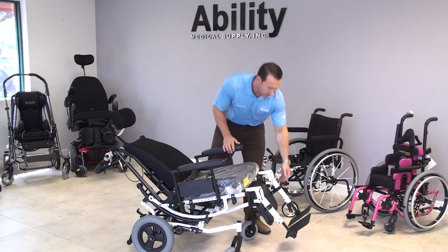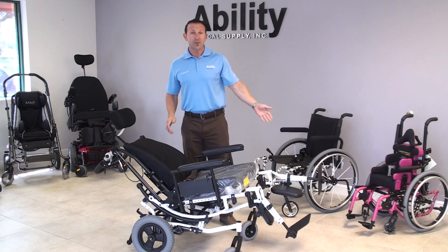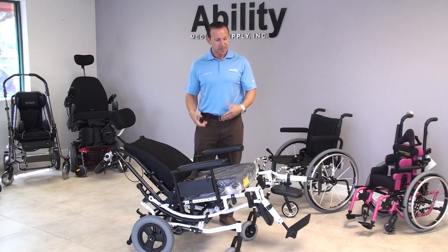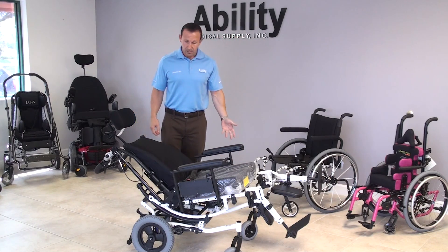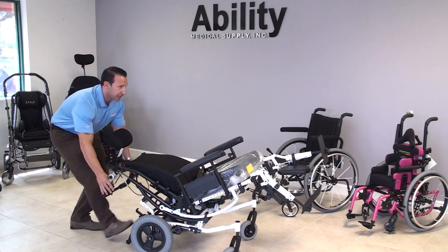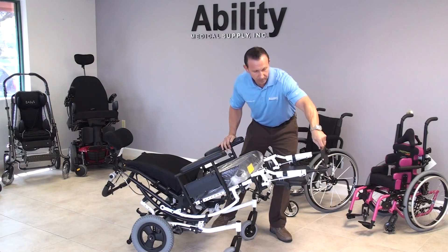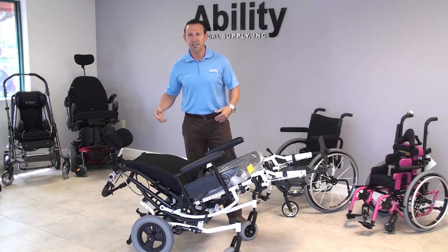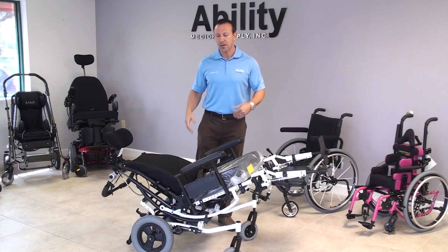Another great feature this chair has is what we call elevating leg rests. Elevating leg rests are good for edema control if people have swelling of the feet, and for positioning. Another neat thing about a chair like this is we can actually get the patient's feet above their heart. If we have the legs elevated, we can get the feet above the heart, and that's really good for circulation — the idea being to get the blood flowing and to relieve any pressure points on the body.